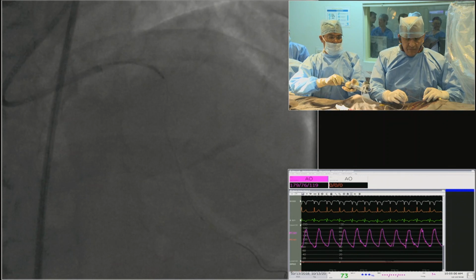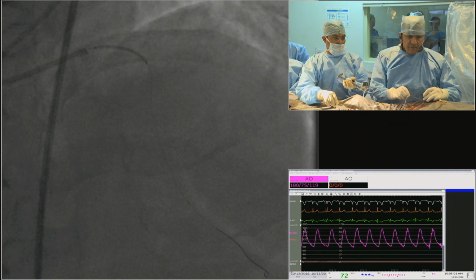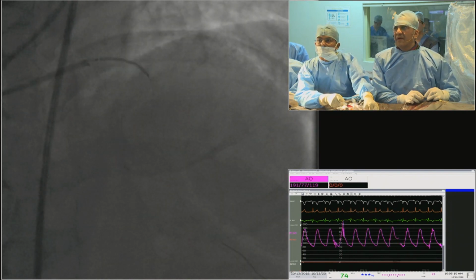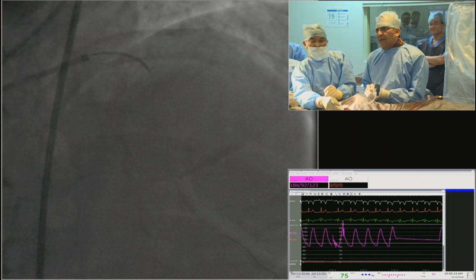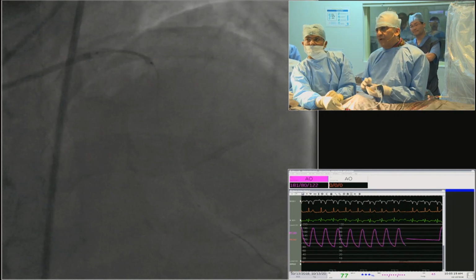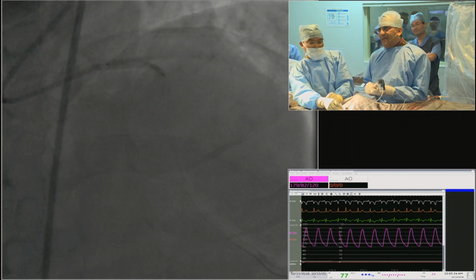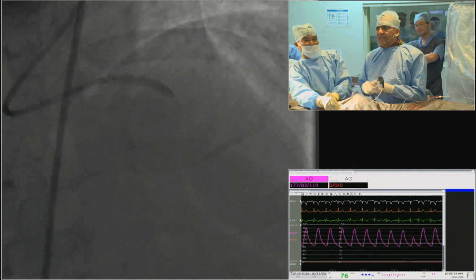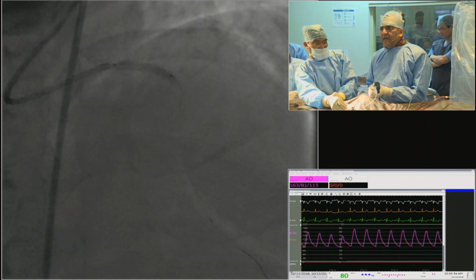And choice of stents. Would you use any stent, or would you prefer a particular stent because of the expansion characteristics or the stent geometry? So my favorite left main stent has somehow become the Resolute Onyx for a variety of reasons. But I'm sure everyone has his own pick, everyone has his own favorites. It's just, how do you defend it? There are many ways to defend that, but there could be counter arguments as well. 10 atmospheres.